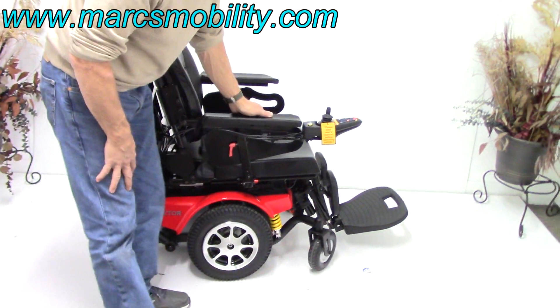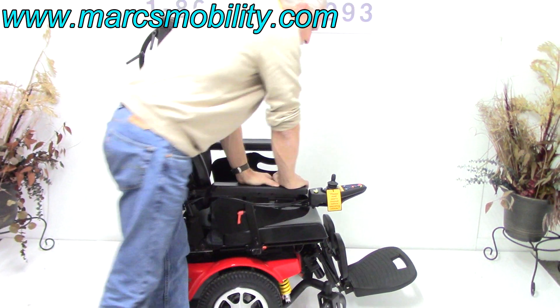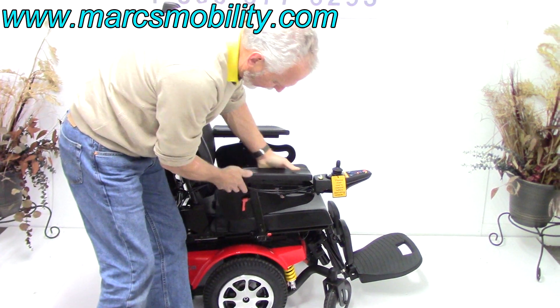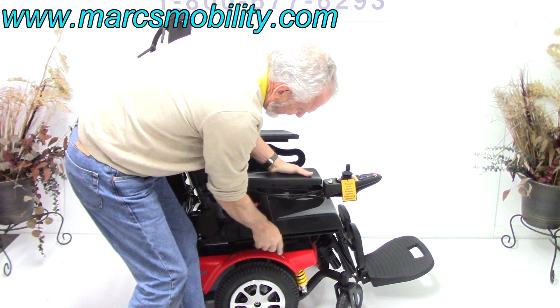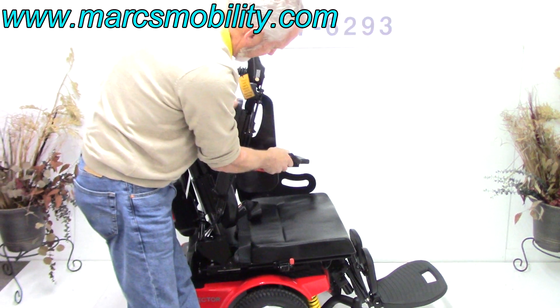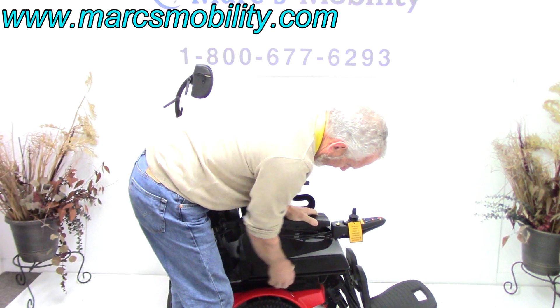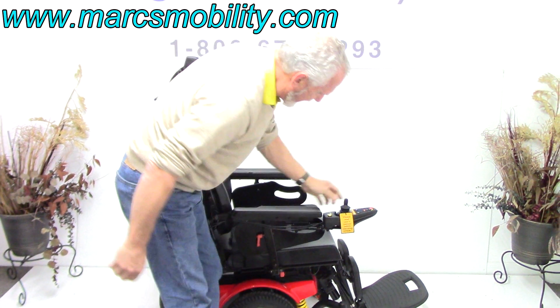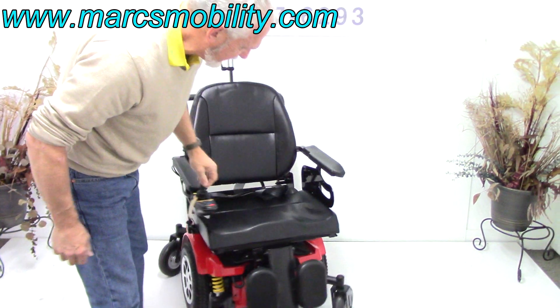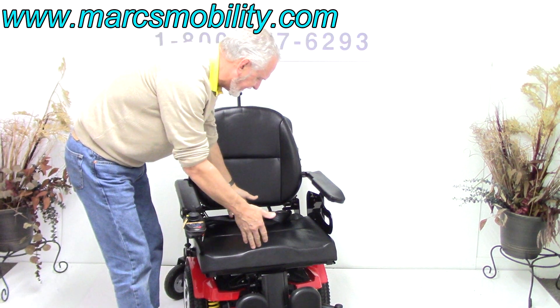There's arm support on this chair, so if you're someone who pushes hard on the arm, these arm supports — which I can remove — give you a little additional support for your arm. You re-lock it and it can't come out. The seat on this chair is 21 inches wide by 19 deep. There's also a safety belt.